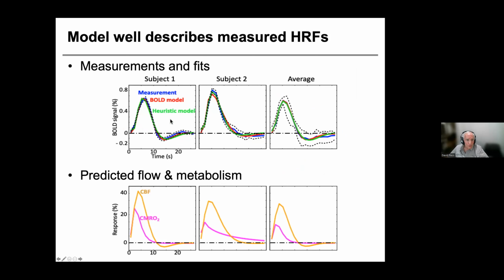Now, some voxels, some HRFs, can show a bunch of high frequency response. To quantify these high frequency phenomena, we use the parameter of high frequency power fraction. In the transform domain, the temporal frequency domain, our Nyquist frequency is 0.4 hertz. So we calculate the amount of power in the upper half of our measurement band, and that fraction of the power is going to be another parameter that we extract.